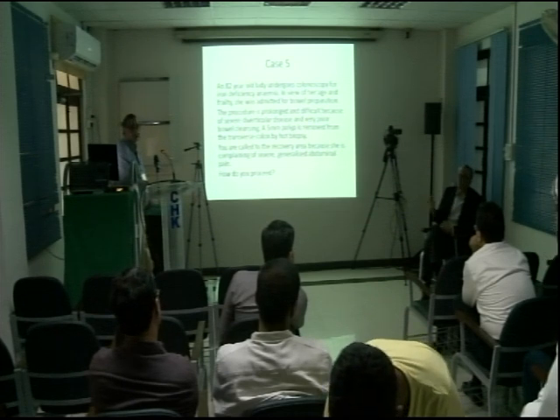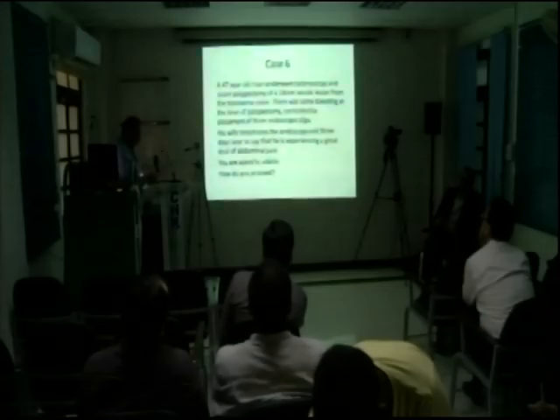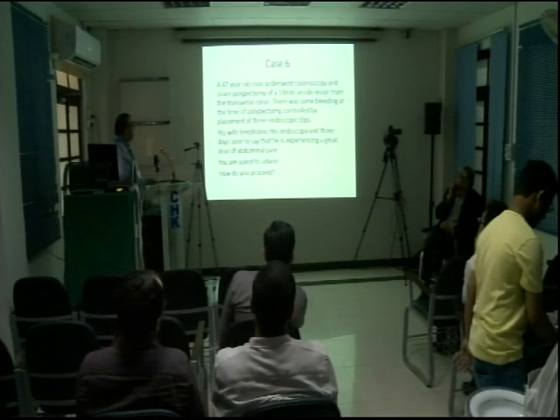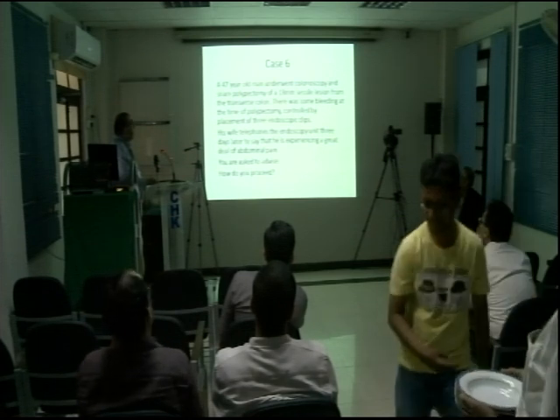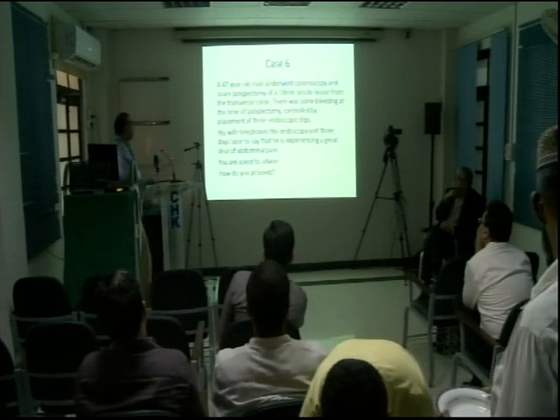Next patient. A 47-year-old man underwent colonoscopy and had an 18 millimeter sessile lesion, which is obviously high risk, from the transverse colon.